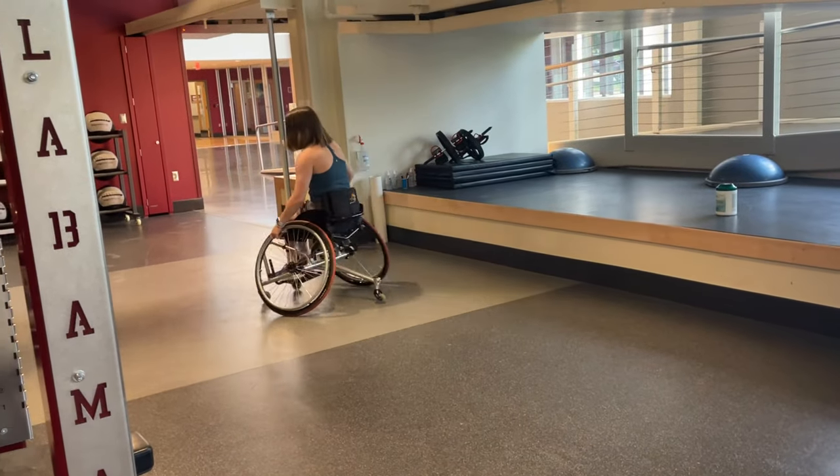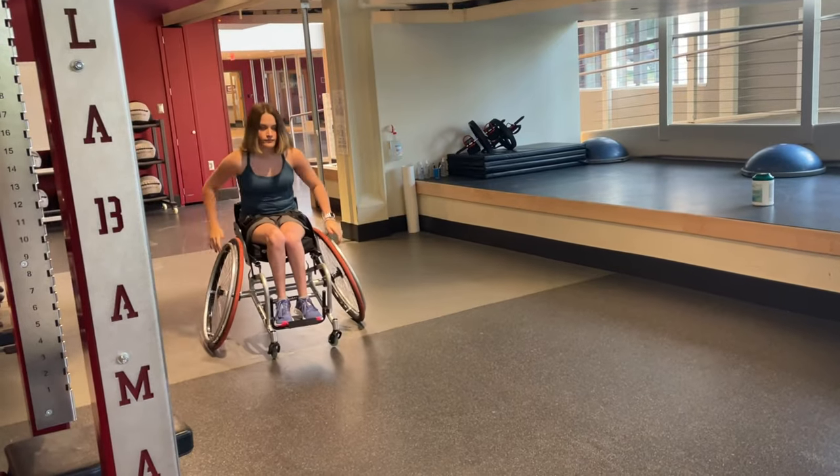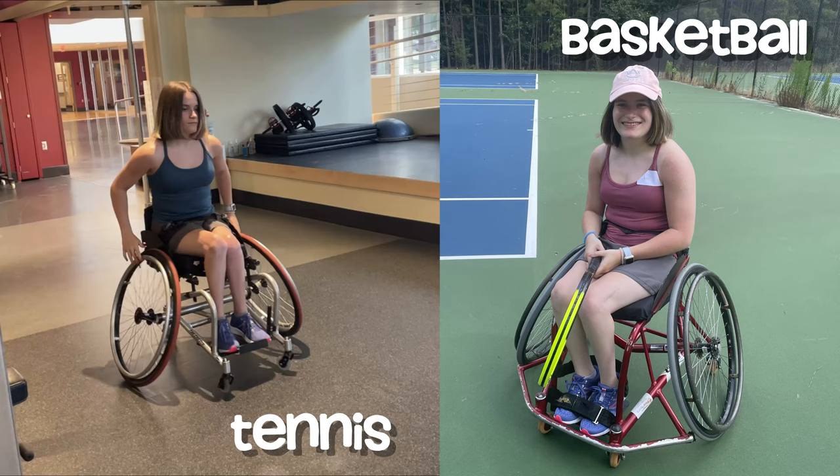Right off the bat, my tennis chair has slanted wheels that most sport chairs have, and that's to make sure it doesn't tip over. There are different kinds of sport chairs — you can have a tennis chair or a basketball chair. A basketball chair can be used for tennis, but a tennis chair can't be used for basketball because basketball in a wheelchair requires a lot of collisions and the chair has to take a lot of damage.